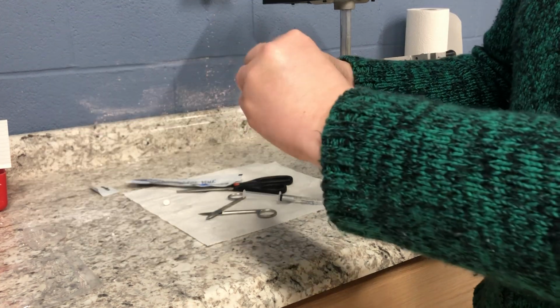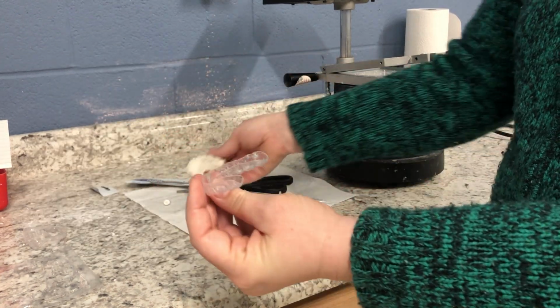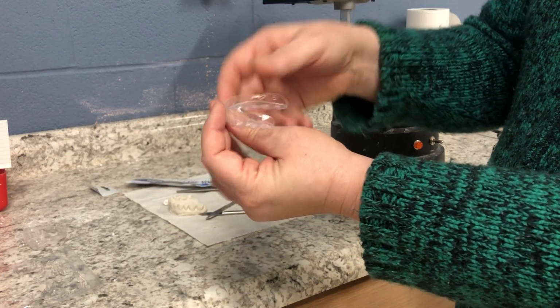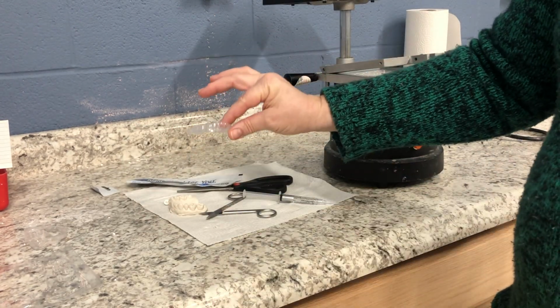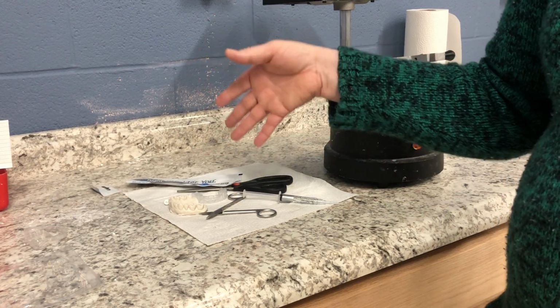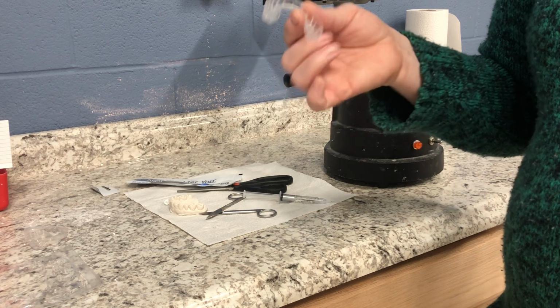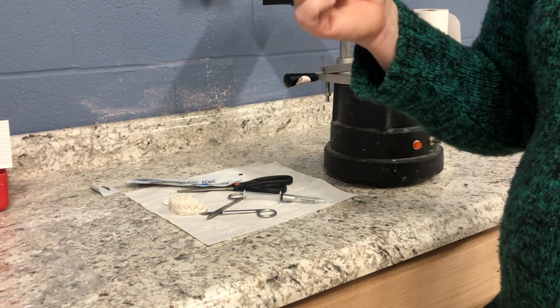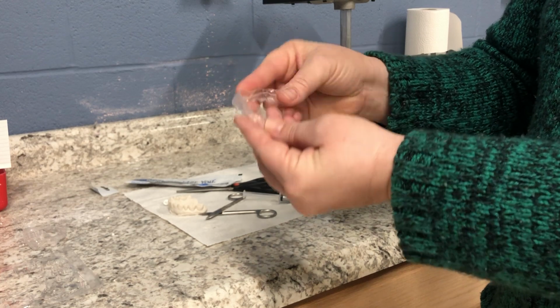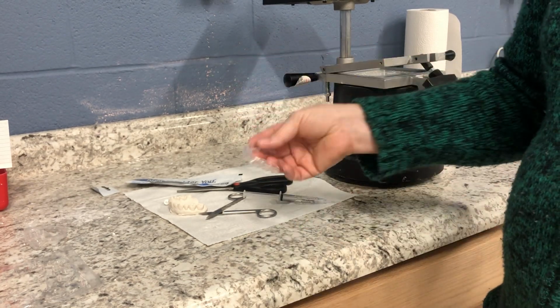Okay, then once you take this off in the morning, you want to rinse it out really good, brush it with your toothbrush, rinse it again, and then set it upside down so that the water can drain out. Don't put this in your dishwasher or in hot boiling water, because again, this will warp and then it won't fit your patient anymore. Okay?